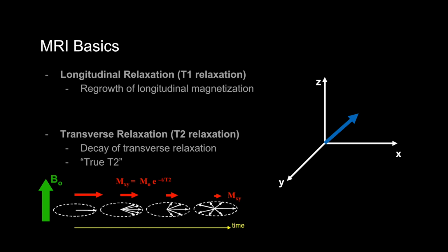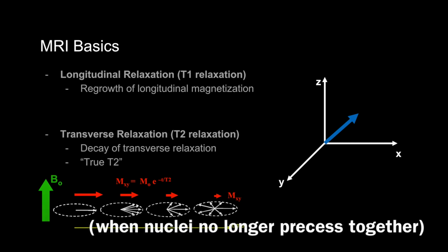But there are other additional interactions that can also result in more T2 relaxation, as illustrated in this diagram down here where we lose phase in the xy plane. Remember, the precession has to remain in phase to keep transverse signal, so there is further loss of signal when they lose phase coherence.